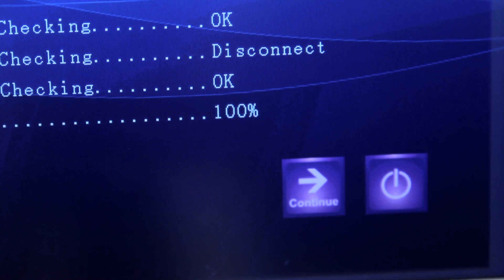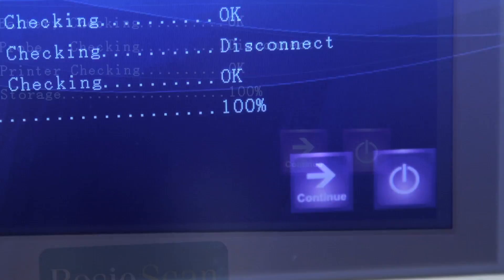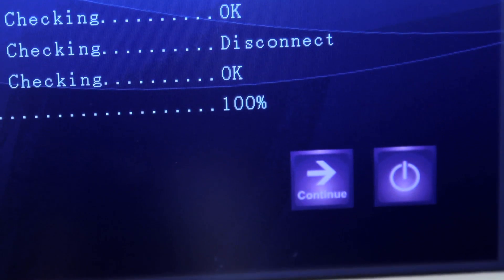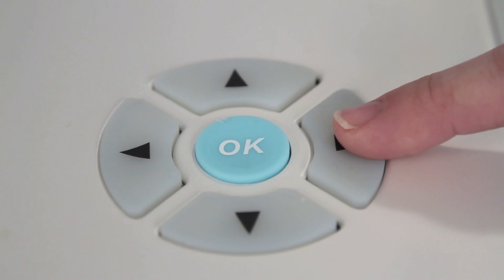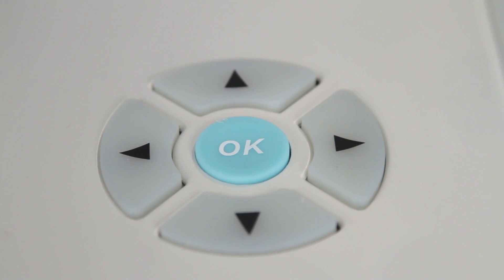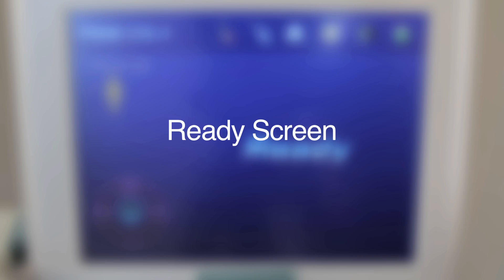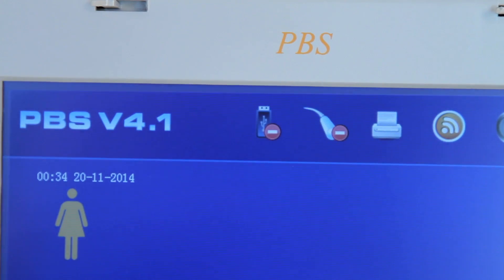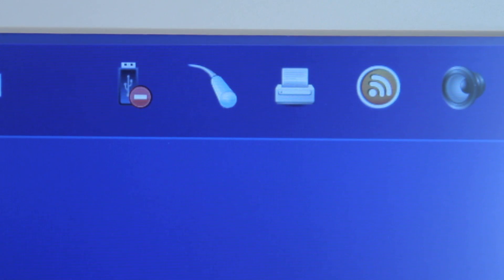At the bottom right corner of the power on screen, there will be two functional keys: Continue and Power. The Continue functional key displays when self-checking fails. Touch the Continue key or press the right directional key in the navigation keys on the control panel to enter the Ready screen. On the top of the Ready screen, you will see a status bar. The icons below may change depending on the device's self-check results.